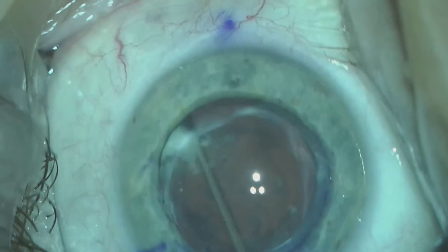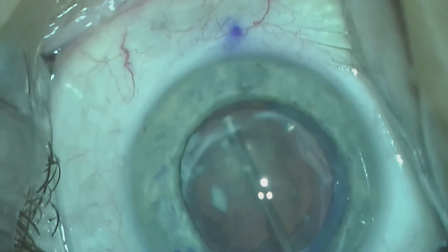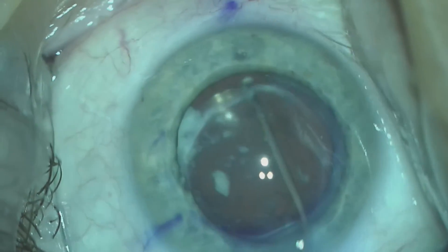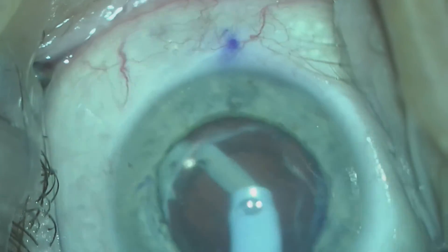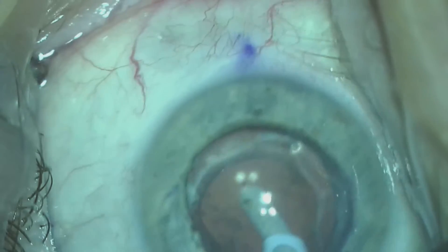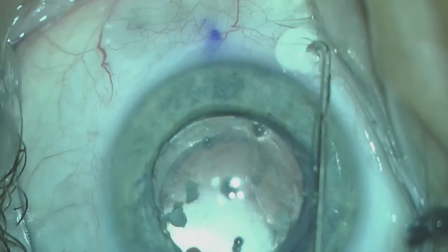At this point in the procedure, we decide to clear some of the residual cortex. This is done with both a Sinski hook, irrigation aspiration, and visco-dissection of the cortex.